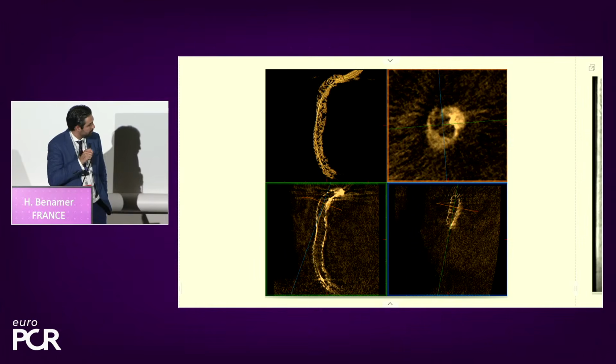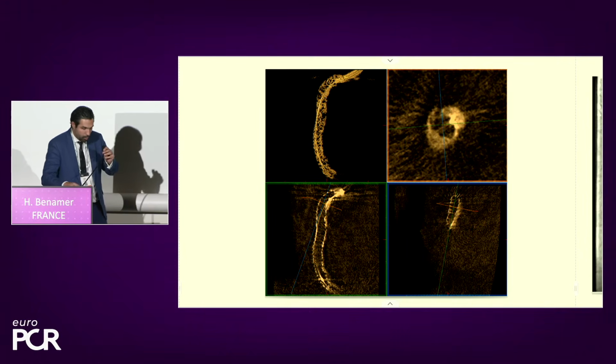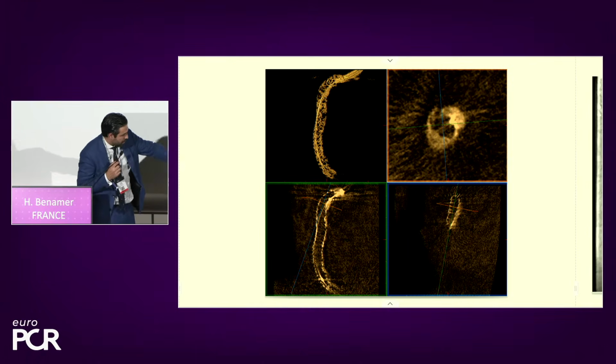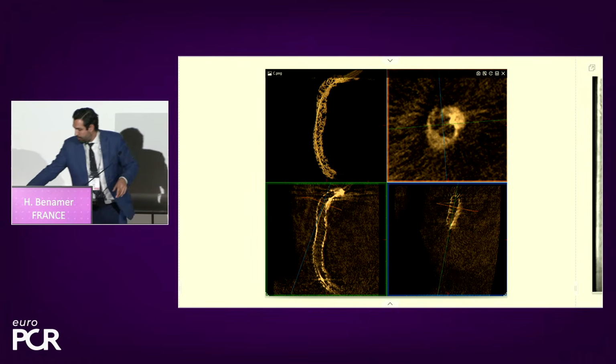And here you have one example, the one that was shown by Dr. Hakeem. Do you want to spend a little bit of time describing the calcium and what we can get in terms of imaging? Well, you see very clearly here, Giulio, you need to help me here. In the longitudinal view, you see the calcification here. You want to get to the microphone?